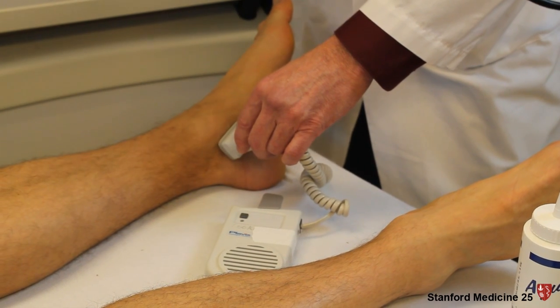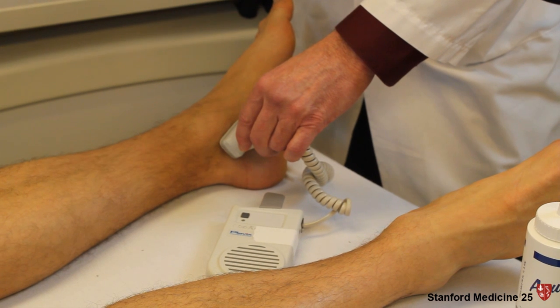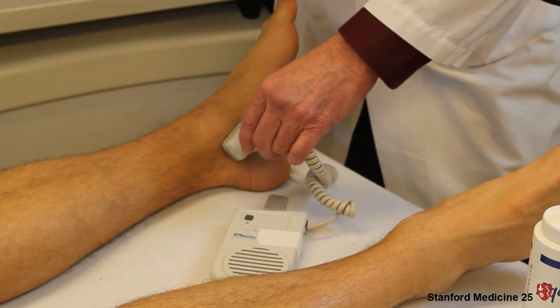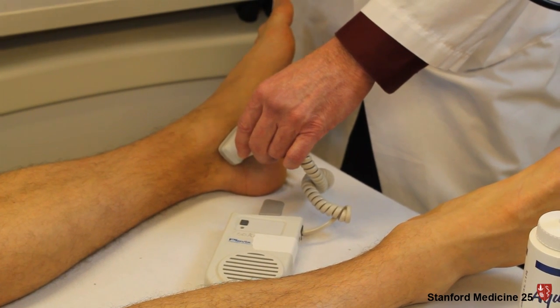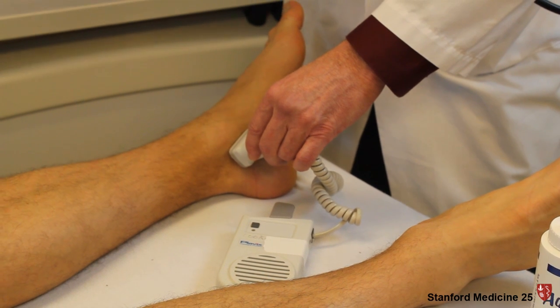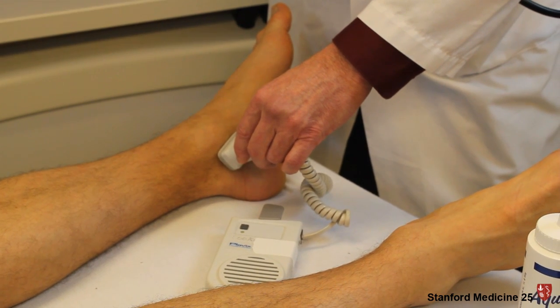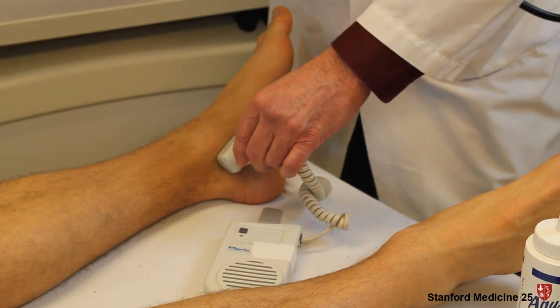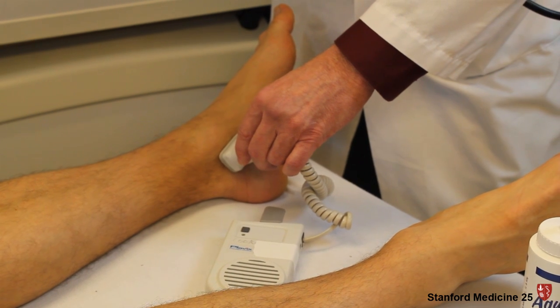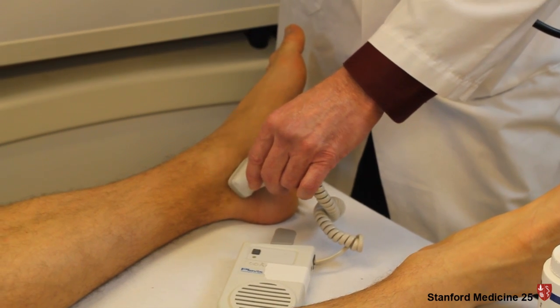You want to move up the leg and do the same thing over the popliteal space. Listen for the popliteal artery, and again do compression, this time of the calf. You should hear a robust venous signal if the individual has an open venous system.